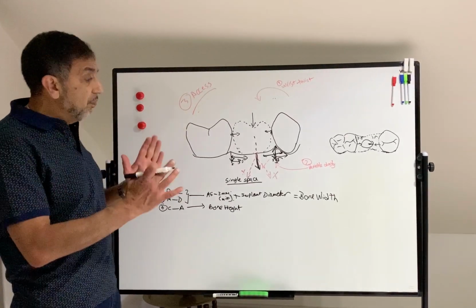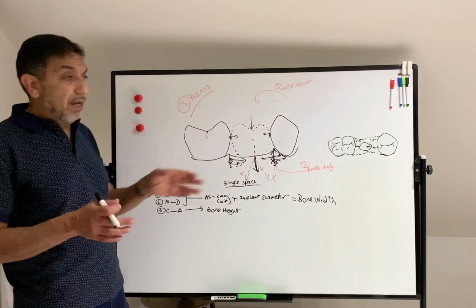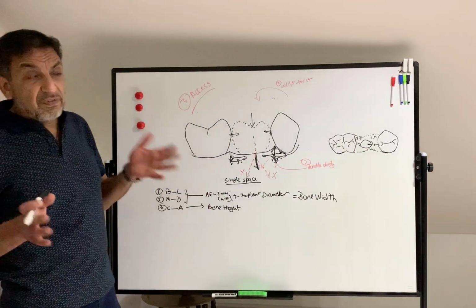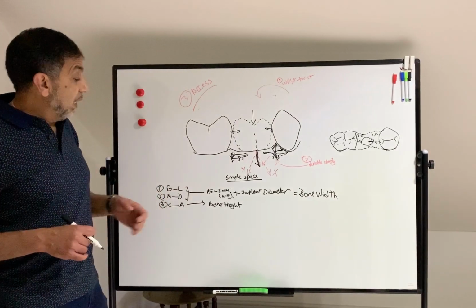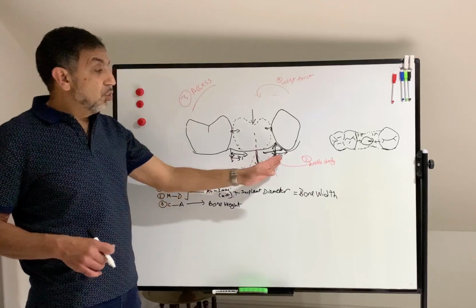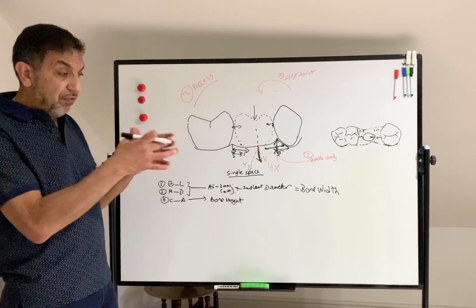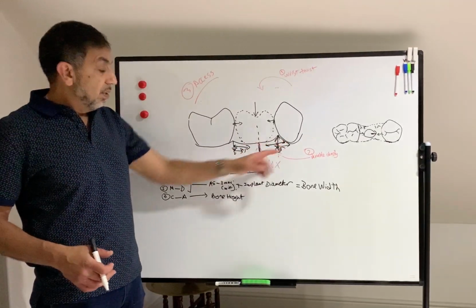Okay, positioning of the implant, buccolingually, you have to have 2 millimeters of bone buccally and 2 millimeters palatally, 1.5 is acceptable, but I would say 2 millimeters as well, right? Between the implant and the adjacent teeth, there should be at least 1.5 millimeters between the implant periphery or circumference and the teeth on either side.